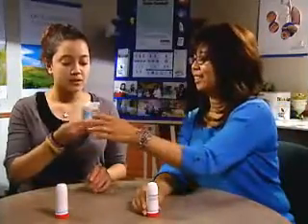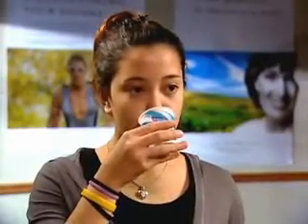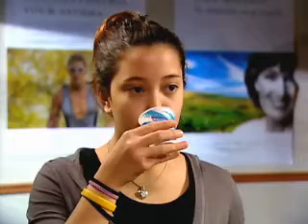After taking the medication, it's important to rinse with water, gargle, and spit out. Inhaled steroids left in the mouth may upset the normal balance and allow yeast to grow.